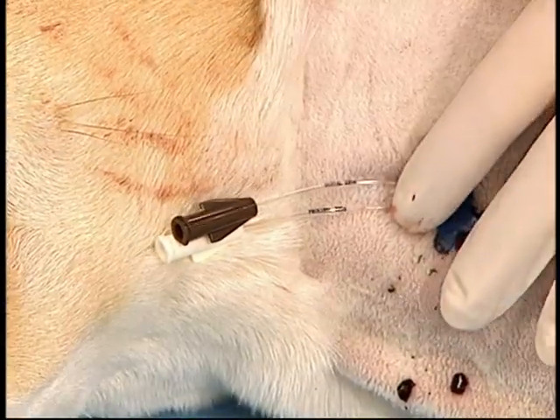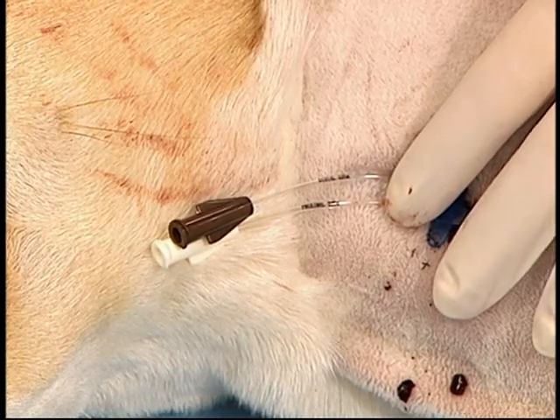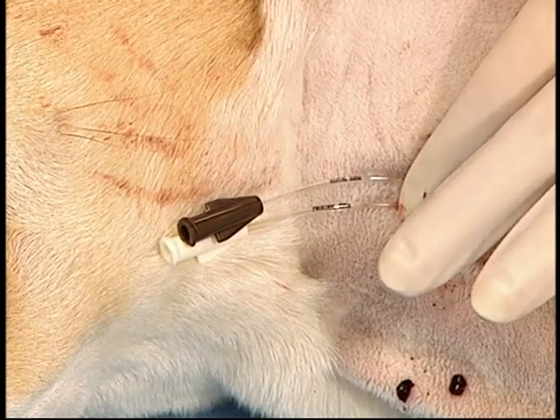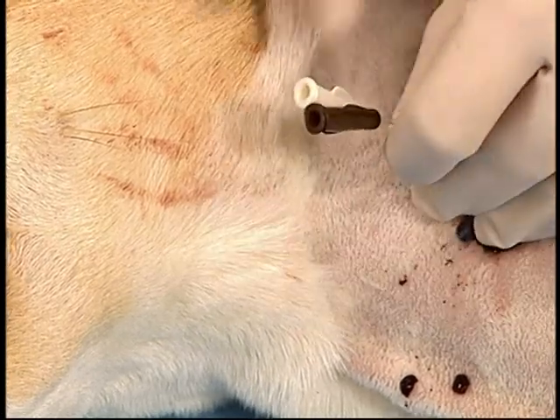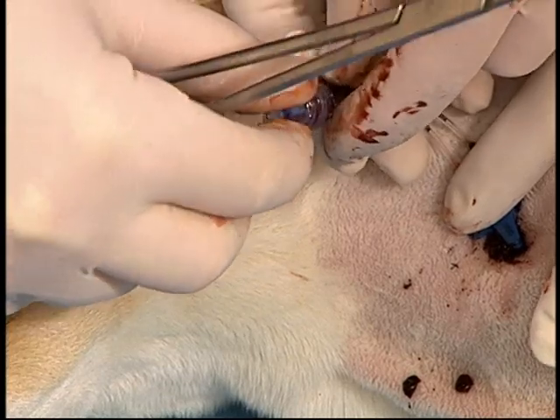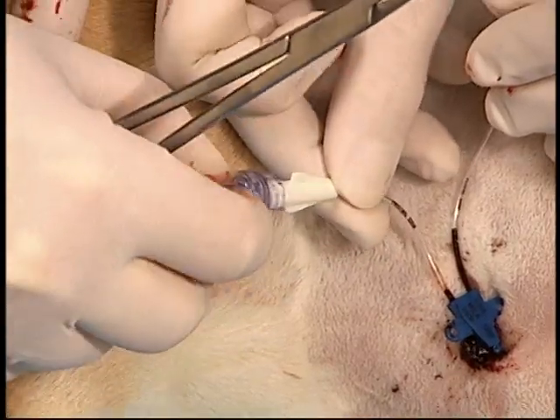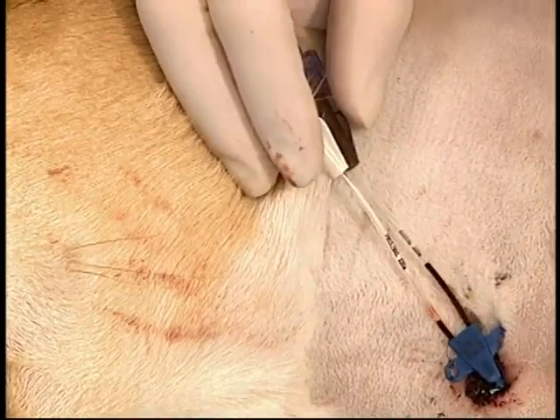Multi-lumen catheters come with two or three lumens. Each lumen is identified by its gauge and location. The advantage of multi-lumen catheters is that irritating or incompatible fluids can be administered simultaneously since the exit ports are at different sites on the catheter. A needleless injection cap is then inserted over the top of each hub to prevent blood leakage from the catheter, and then the catheter is sutured in place.